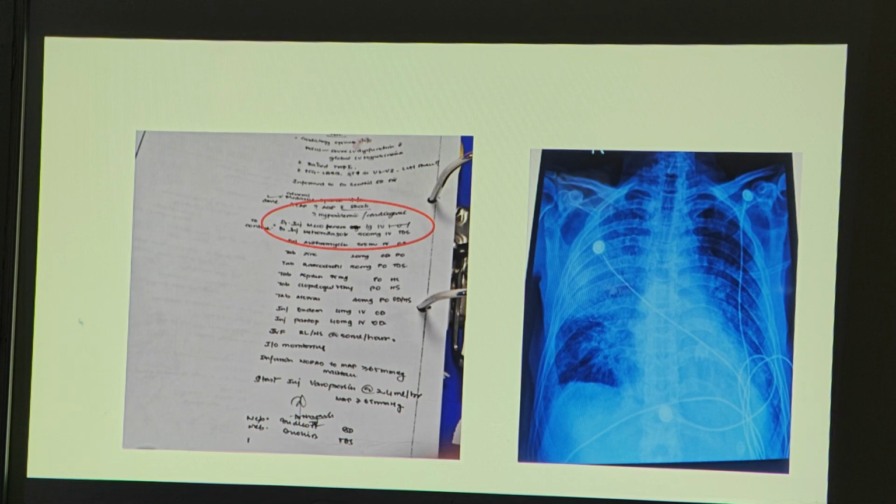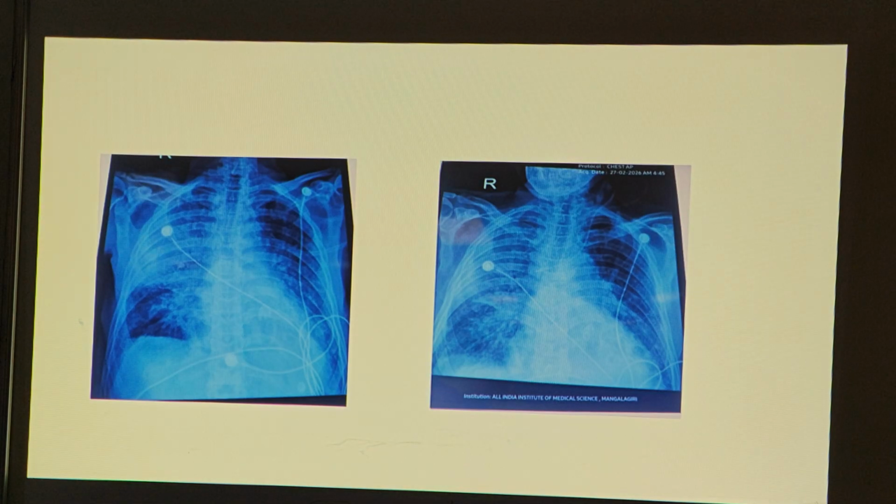This is the chest x-ray on the day of admission. You can see the right side of the lung, the middle lobe and upper lobe involvement, and consolidation patches are there in the chest x-ray. So these are the next day x-rays. Now the entire right part of the lung is involved. It is a progressive disease, that is, the pneumonia is progressive, the patient having severe respiratory acidosis and the sepsis features are also there.